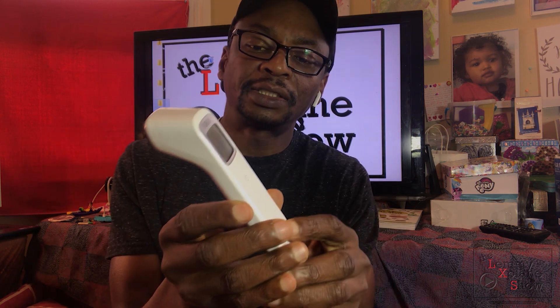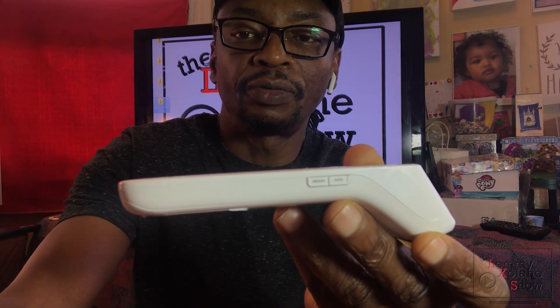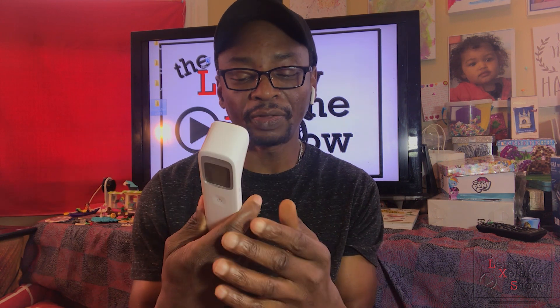Without the cover, this is what it looks like. The screen still has the plastic on it. You've got the memory key and the reset button right there, and also the mode button. I'll do a close-up video of this so we can have a closer view as I talk about the thermometer after I've used it.